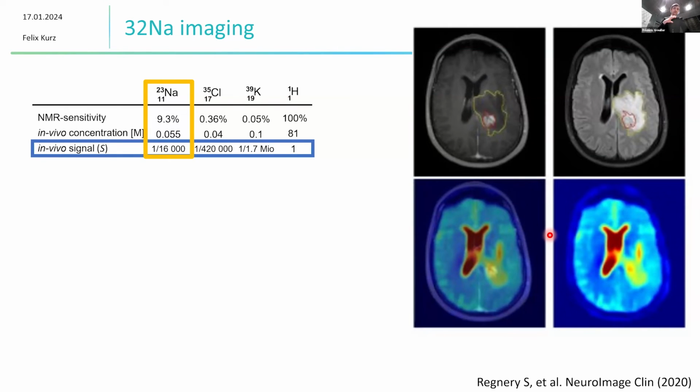So basically the sodium potassium ATPase shuts down in the cellular membrane, and the sodium accumulates intracellularly. And this can be measured, and you get information on what's happening, but still the resolution is okay. But I think Siemens already has an FDA approved coil for sodium imaging at 7T, or at least it was in the process of being approved.